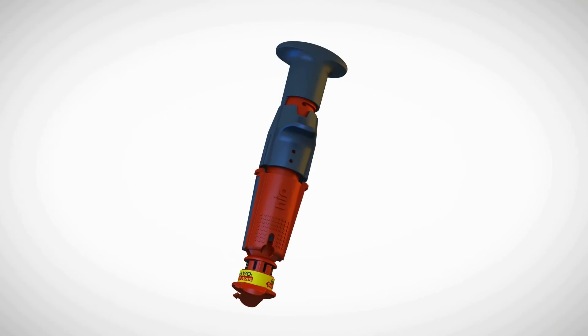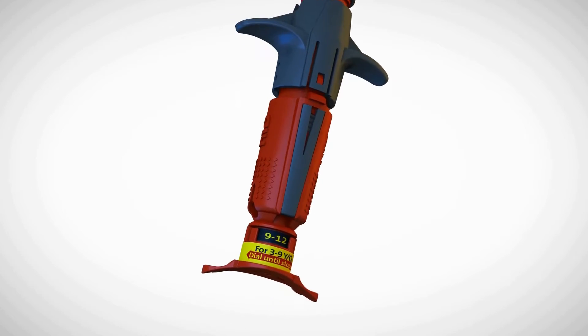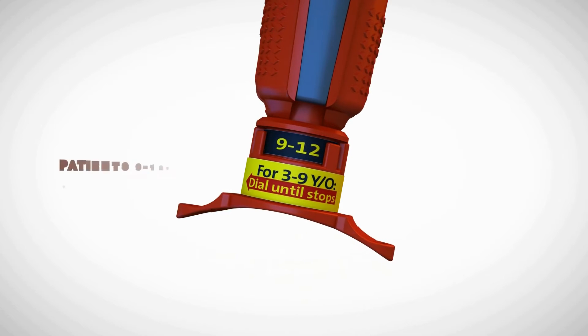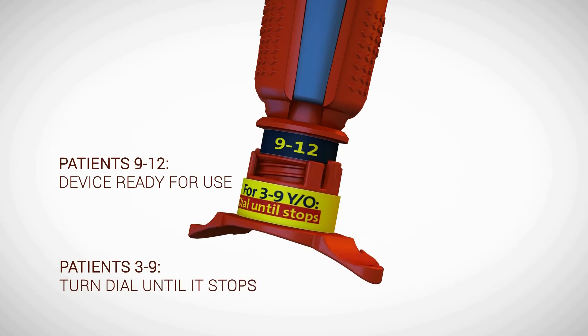The NeoP is a spring-loaded I.O. device that is designed to be easily inserted into the tibia in all clinical settings. The NeoP is a single-use I.O. device which can be adjusted according to the age of the patient.